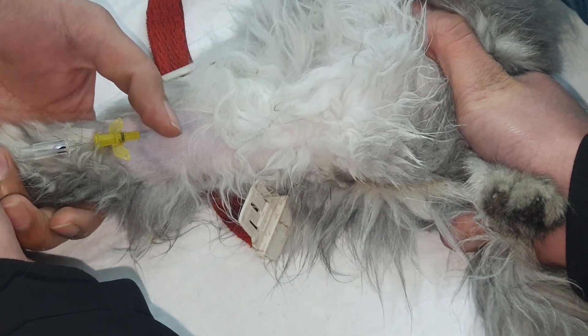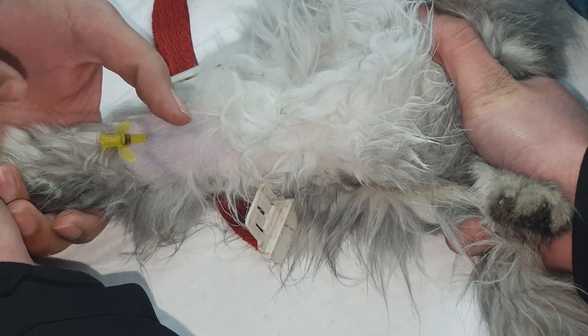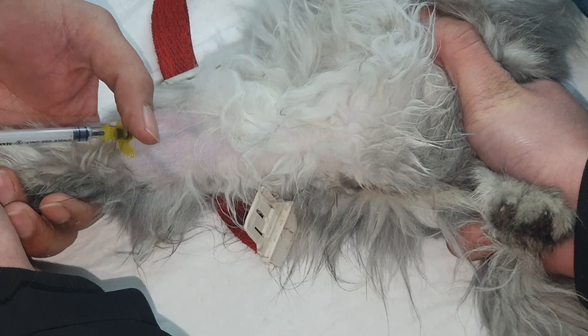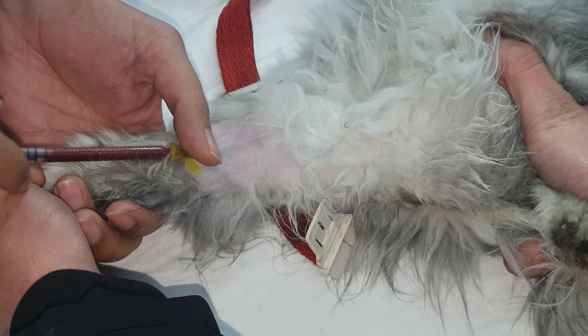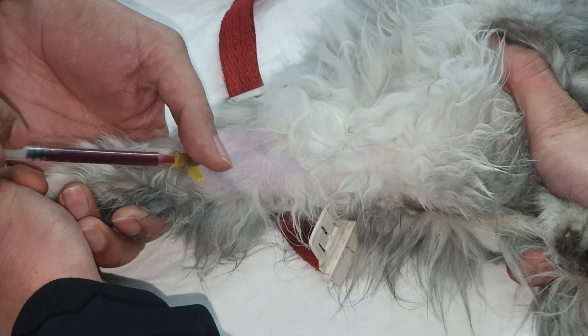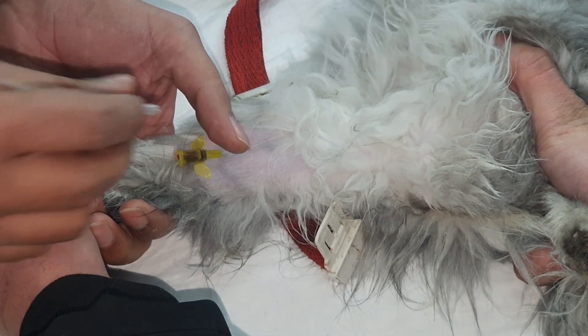We could also take a blood sample from that vein by just placing the syringe in the branula and pulling it out. You could see how easily we could collect the blood from that vein. After collection, we will simply proceed to secure the site.